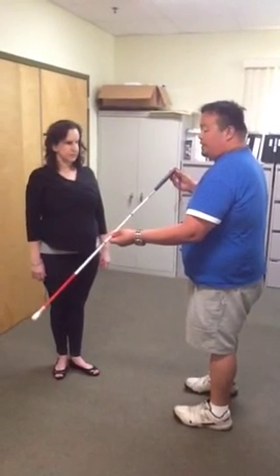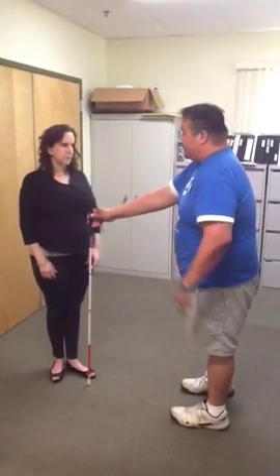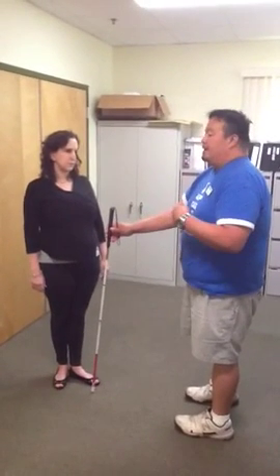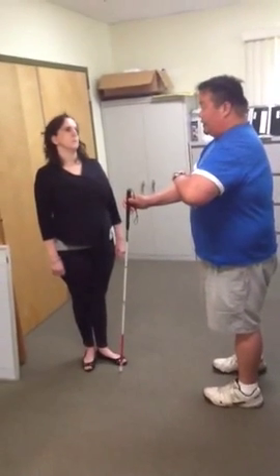And the way we measure for a cane is it's going to go just where your sternum is, and a little higher than your sternum. But depending on your comfortability with the cane, depends on the length. But it'll never go shorter than where your sternum is at.